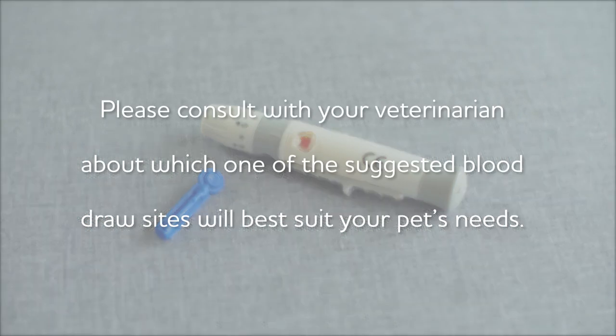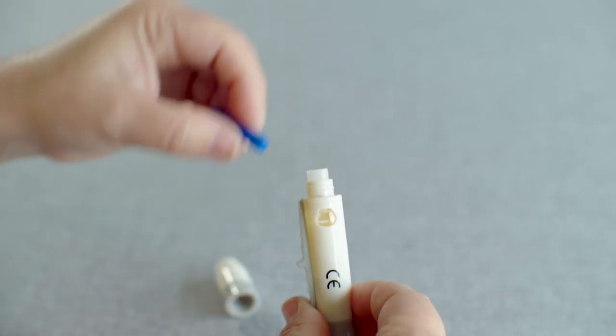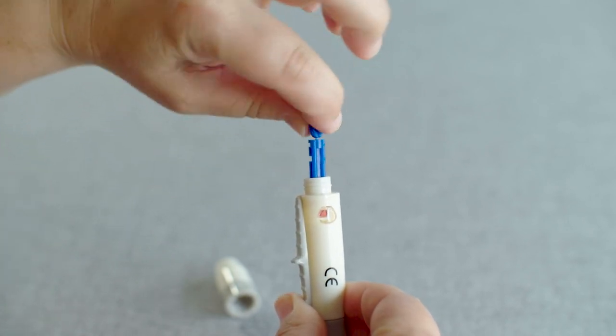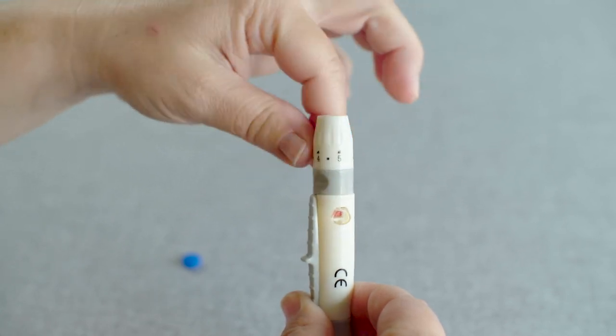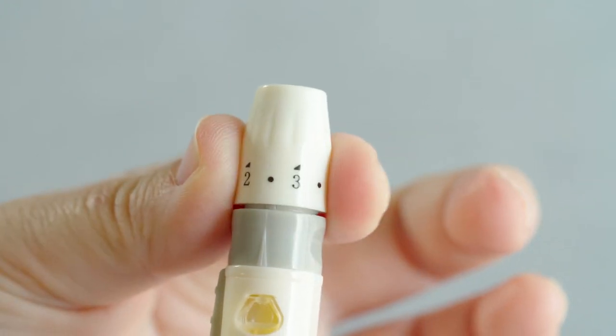Please consult with your veterinarian about which of the suggested blood draw sites will best suit your pet's needs. Unscrew the lancing device cap and insert the lancet with the circular shape facing up. Twist off the round safety cap from the lancet to expose the sterile needle tip. Screw on the lancing device cap. Select the skin penetration depth from 1 to 5.